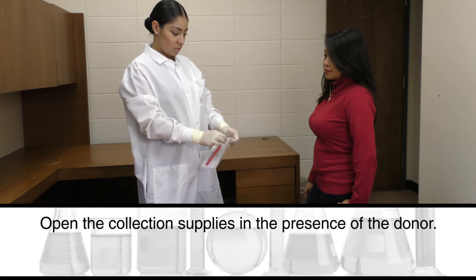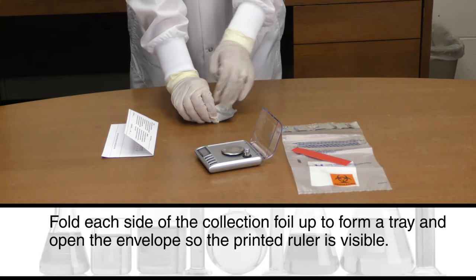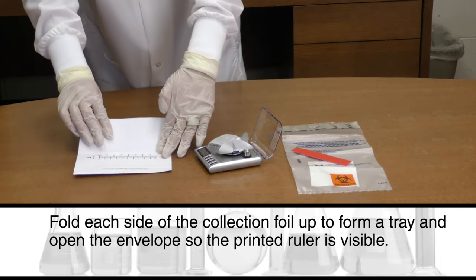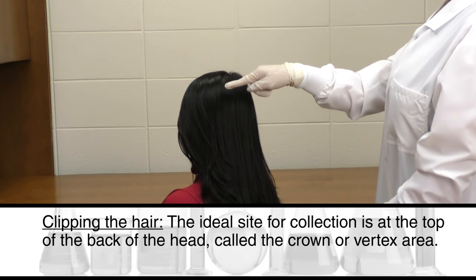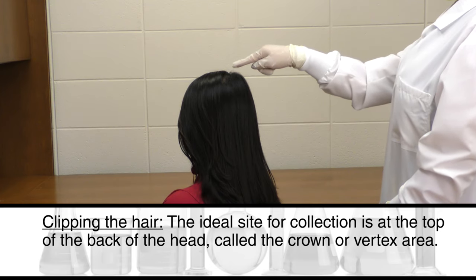Open the collection supplies in the presence of the donor. Fold each side of the collection foil up to form a tray and open the envelope so the printed ruler is visible. The ideal site for collection is at the top of the back of the head, called the crown or vertex area.